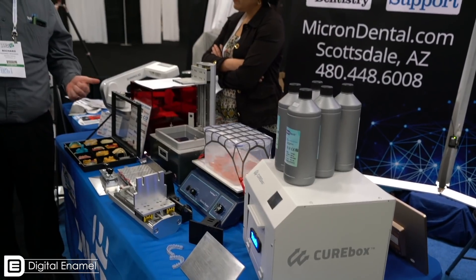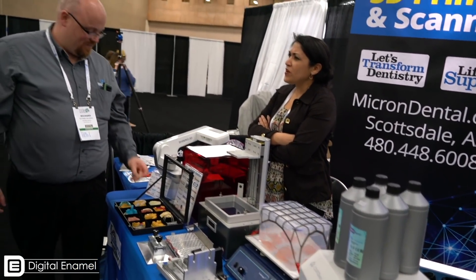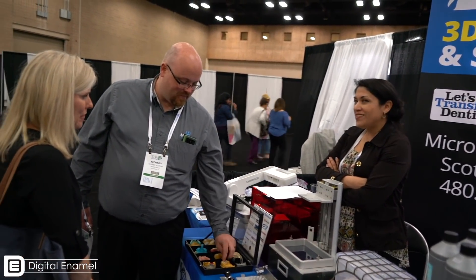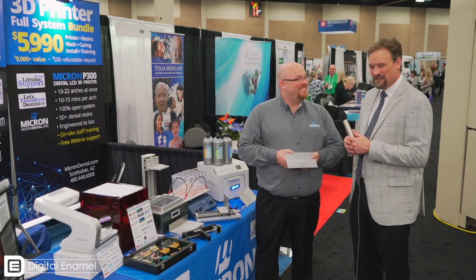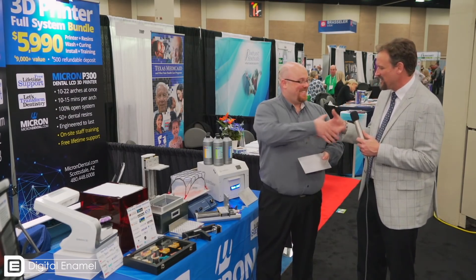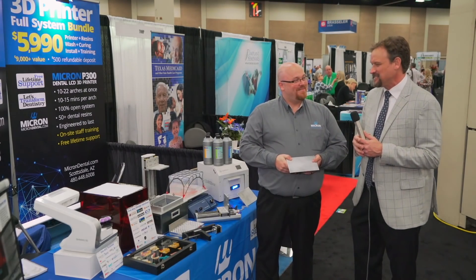I know you're getting ready to launch this — tell me what the calendar looks like. Our official launch — we're going to be at AAO later this week, and the official launch is at CDA in California on May 17th. That's when you'll be able to find more info online. Think of this as a big preview for the folks at Digital Enamel. I'm glad I ran into you — I'm just fascinated by your printer.